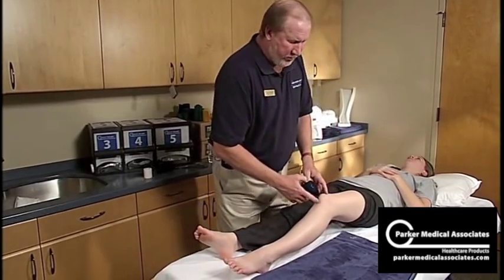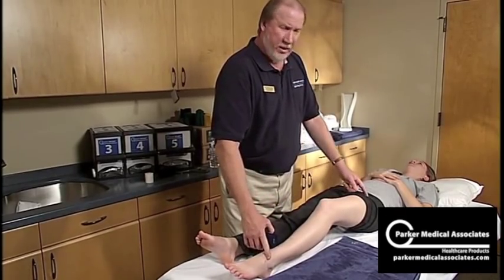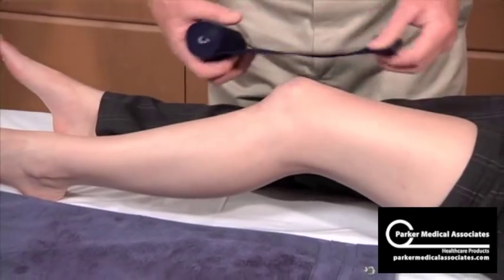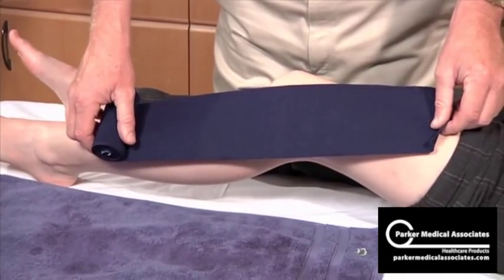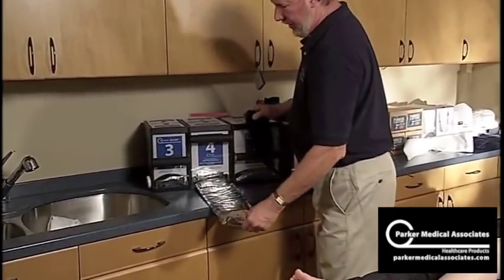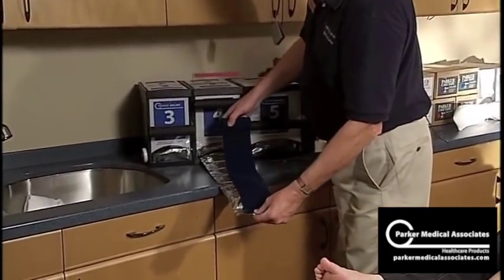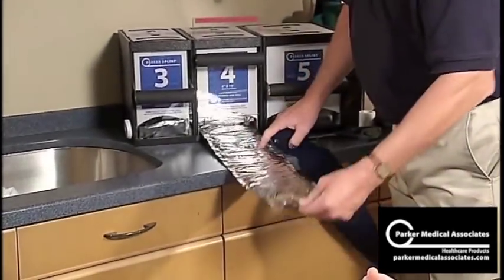Your length would be eight inches above and below the patella — that's all you need to immobilize the knee. You don't have to come all the way down or way up. So we're going to go eight inches above and below the patella. I'm going to double this measurement now, using four-inch, pull it out, get that one-sided measurement, and double it.